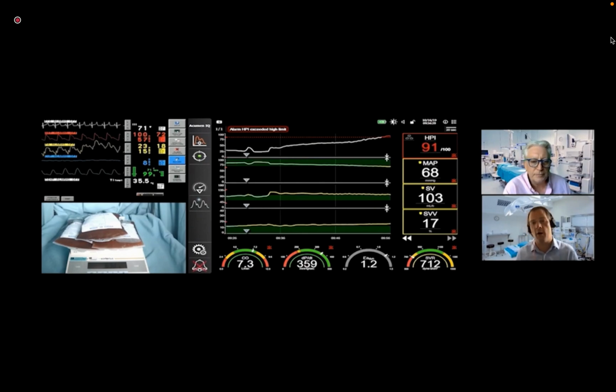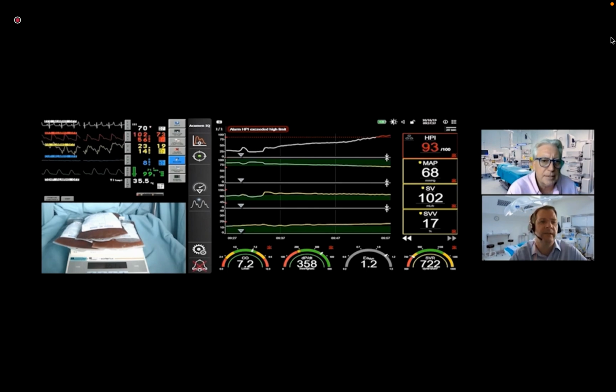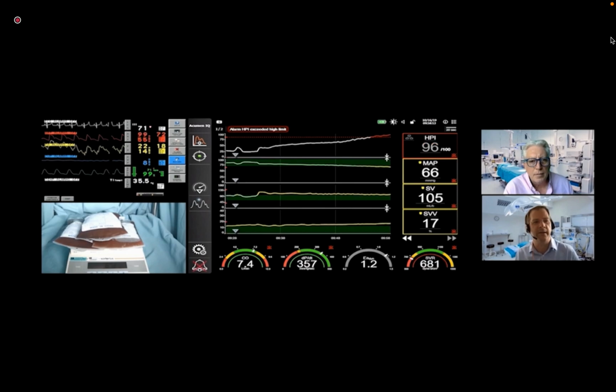Yeah, so I think on our advanced monitor, we've got some clear signs that something's happening. Raised SVV, HPI is up over 90 now. On our standard bedside monitor, though, not a huge amount of change. Some subtle changes, as you say, but nothing particularly dramatic. Do you think you can eyeball the so-called swing in the arterial line? I don't know, my eyesight's failing at this stage, but with the eye of faith, knowing what the SVV is, yeah, you could say that. But it's not crystal clear. It's not a bounding swing on that line, I don't think.